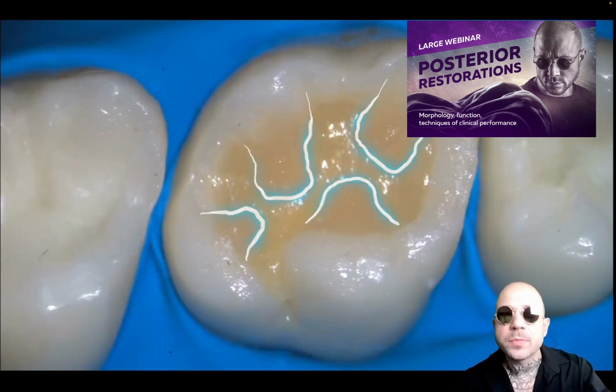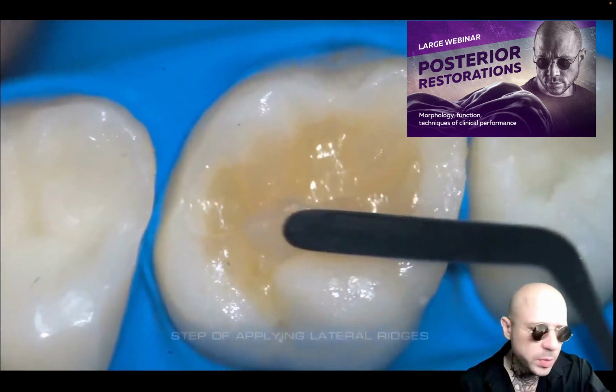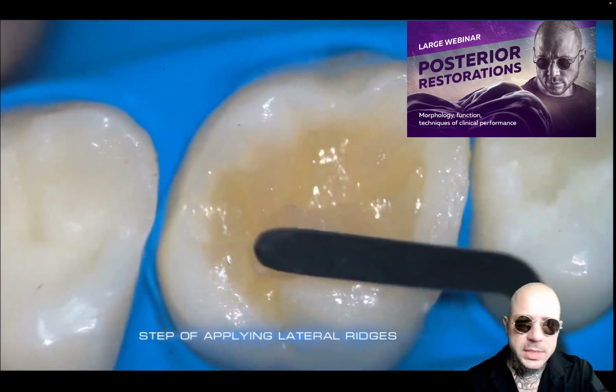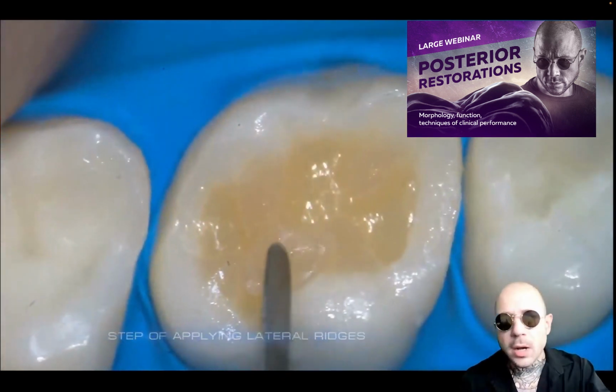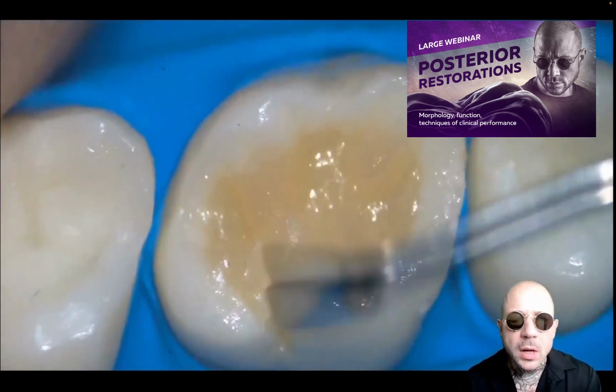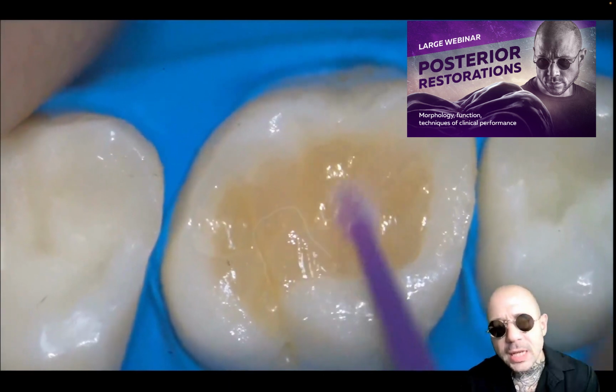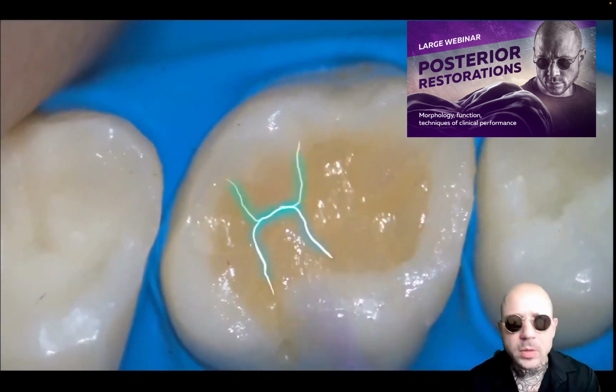So now we need to apply the side ridges. Same process with the same characteristics, but we need to be careful. Carefully follow the places. Do not exaggerate volume.